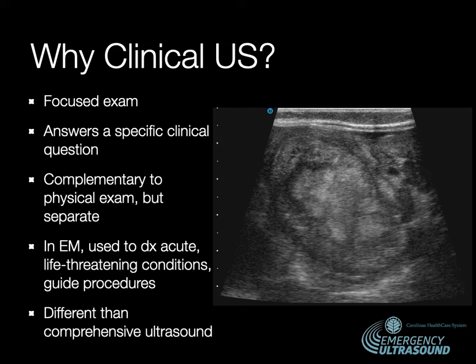We consider it as complementary to the physical exam, but it's a separate procedure and not part of the physical exam. There are many aspects to a good quality point of care ultrasound program, but that's a little bit beyond the scope of this talk. In emergency medicine, we often use point of care ultrasound to diagnose and start treatment on acute life-threatening conditions and to help guide procedures.